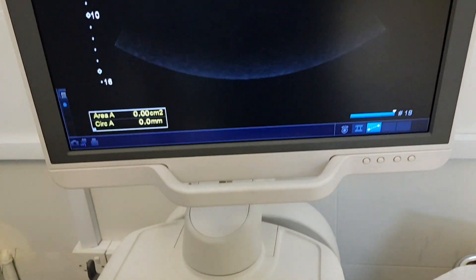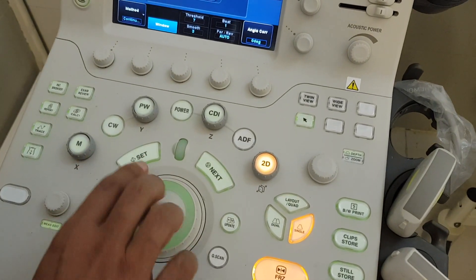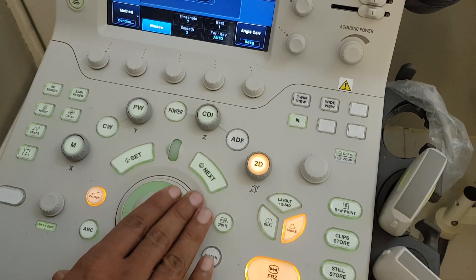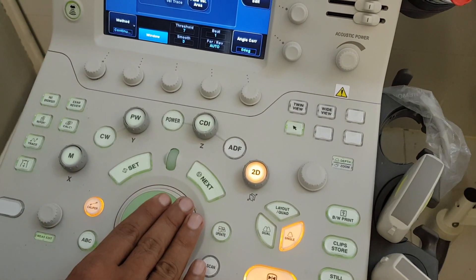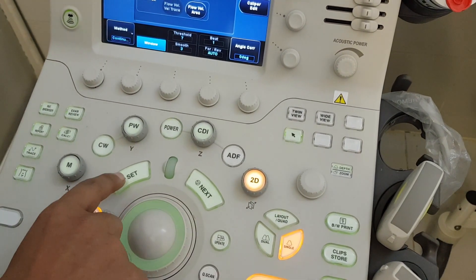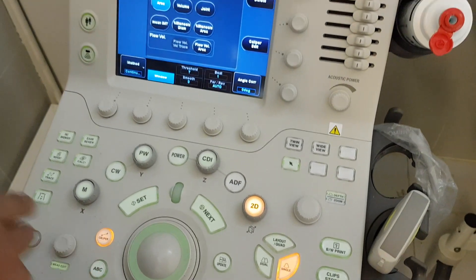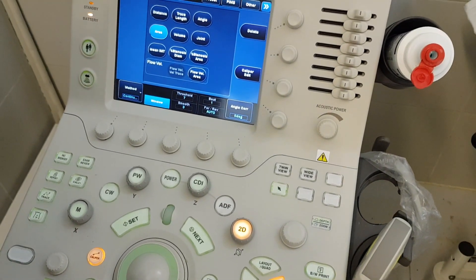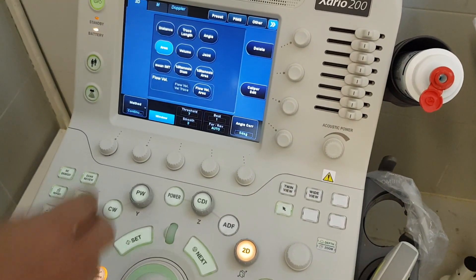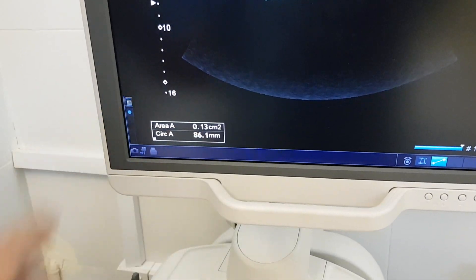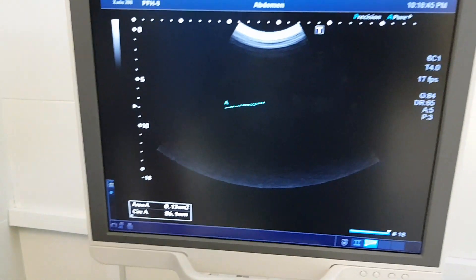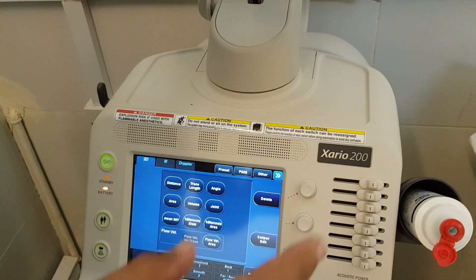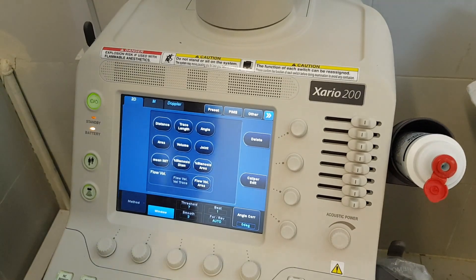You will move it from the trackball. Where you start, press the set button one time, then click on it again and press set again. Then your reading will be displayed. If you want to delete it, click on the delete button and it will be removed.